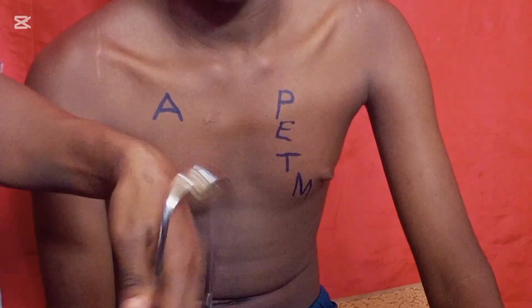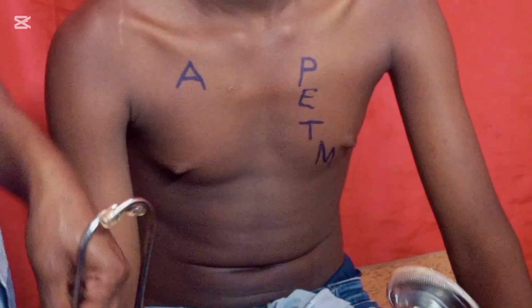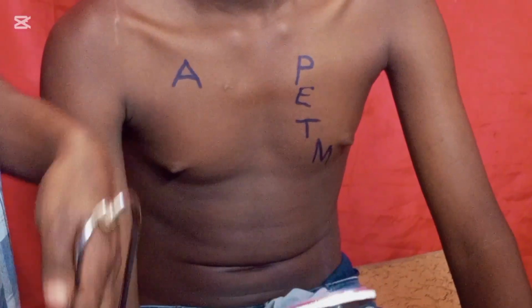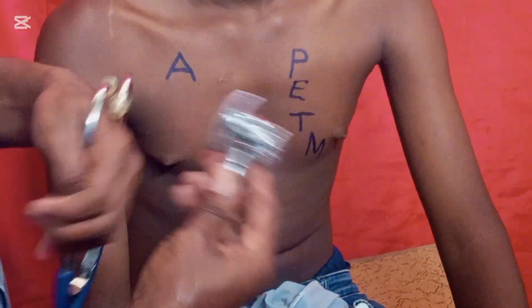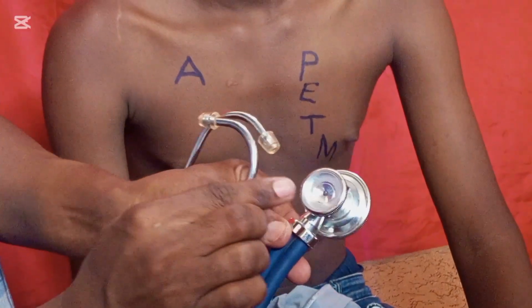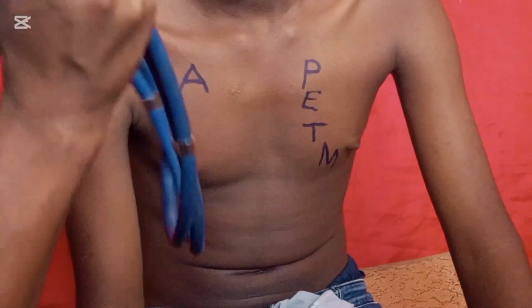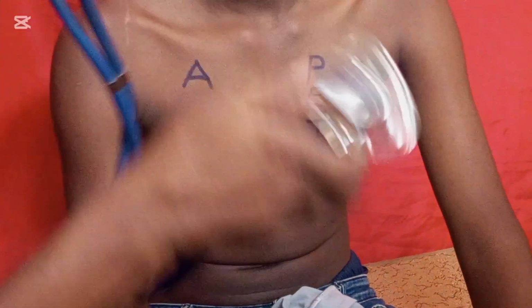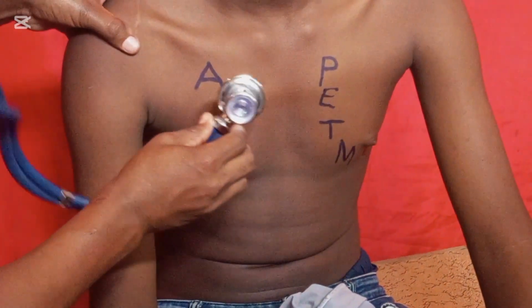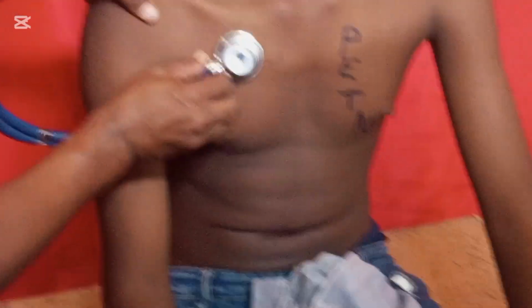When you look at the stethoscope, we have the diaphragm and we have the bell. We use the diaphragm to listen to high-pitched sounds. So first we start listening with the diaphragm, then second we move to listening with the bell. So you place the stethoscope into your ears, then you start listening in the second intercostal space on the right side of the sternum.